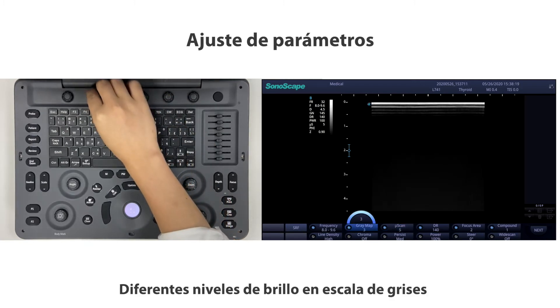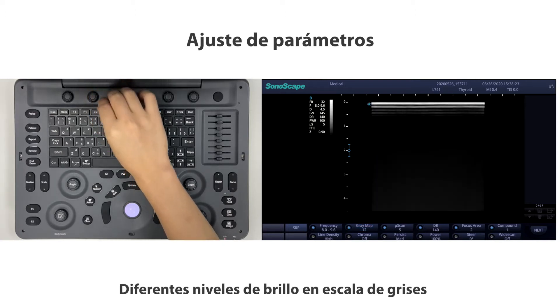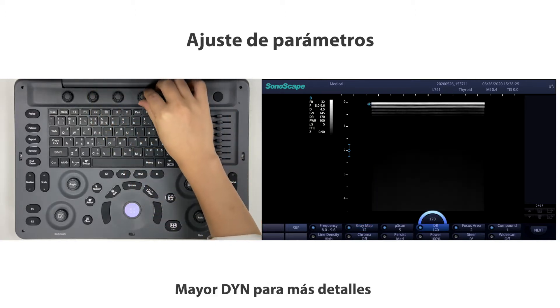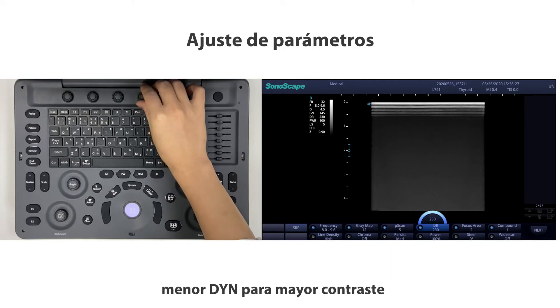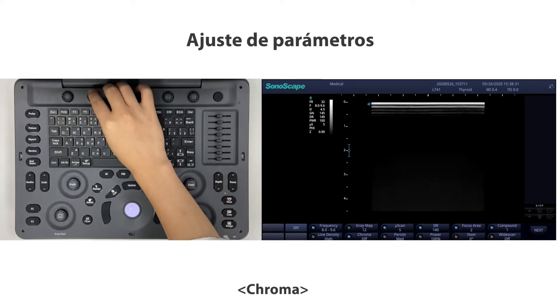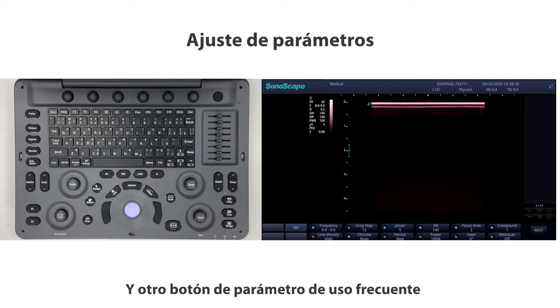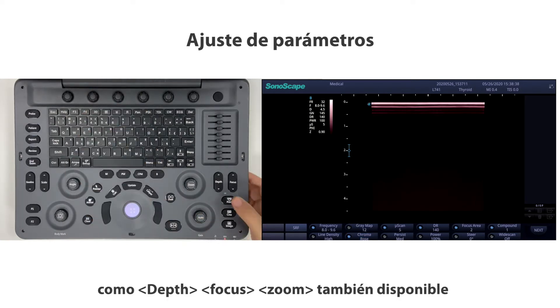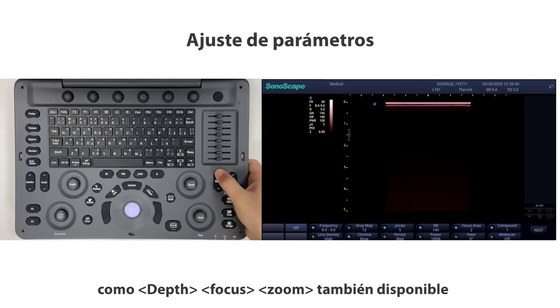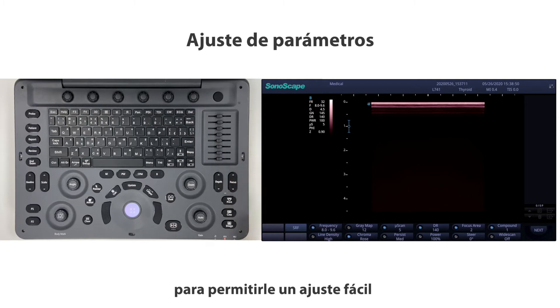Gray map controls different levels of grayscale brightness. Dynamic range — higher dynamic range for more details, lower for higher contrast. Chroma colorizes the image. Other frequently used parameter buttons such as depth, focus, and zoom are also available on the control panel for easy adjustment.